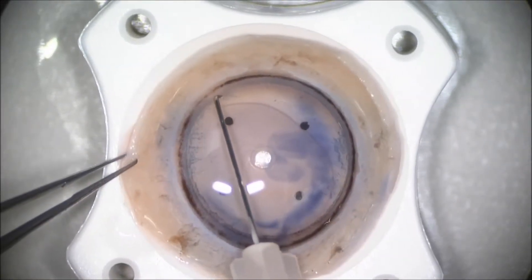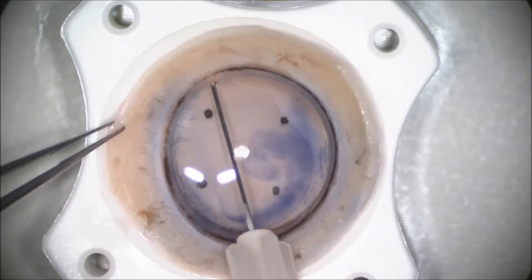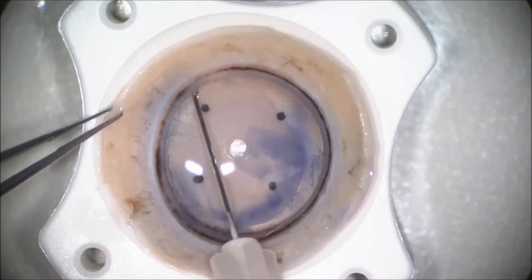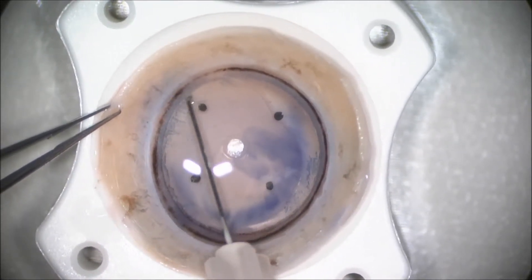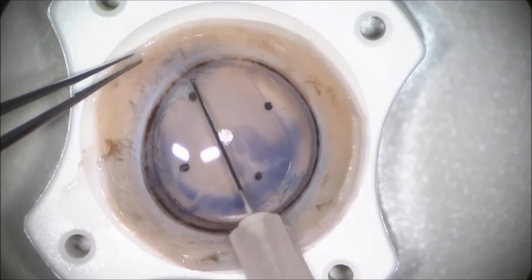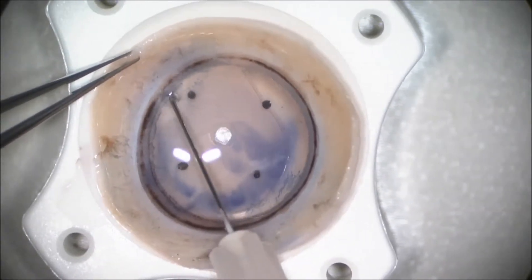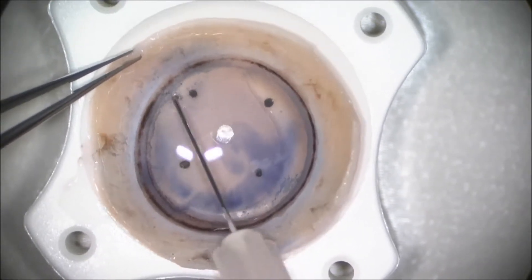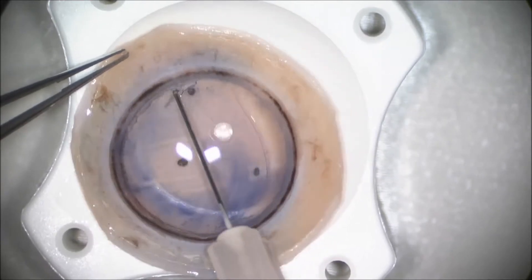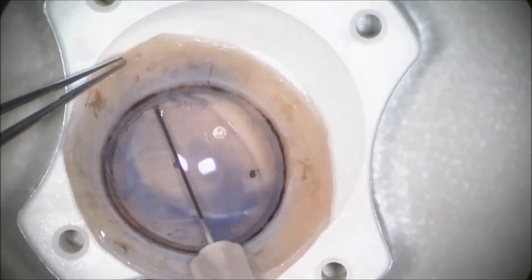Here we're using a bent 30-gauge needle to cut the peripheral Descemet's membrane. We're doing this in a circular fashion, going all the way around 360 degrees.